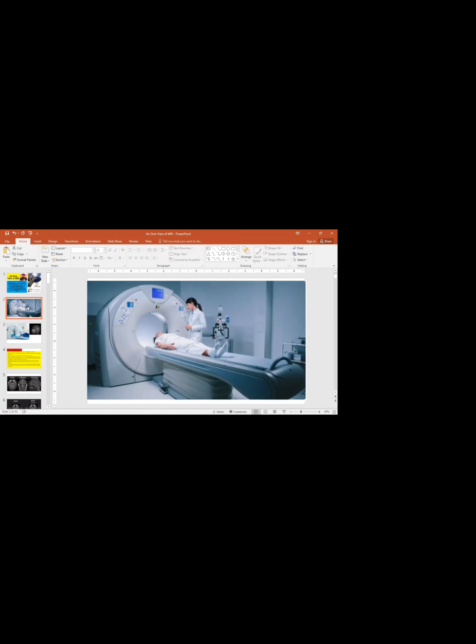So this is the beautiful machine we are seeing with the stretcher, with the patient. The staff nurse is talking with the patient. The patient has to be very calm and quiet in this examination. We don't want him or her to vibrate or move, to make best use of our test, and we try to make good images to study the organ we want to study.